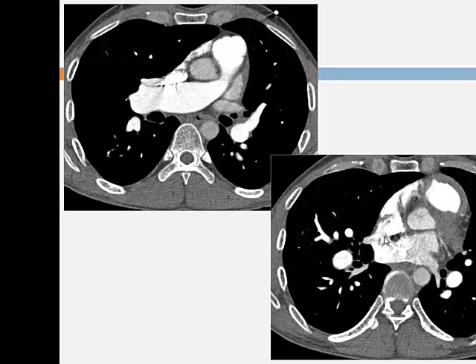If you mention sinus venosus, you need to think about anomalous venous drainage, okay? About 70% of these two conditions coexist. So if you've got one, you must always look for the other. So just check your pulmonary veins.